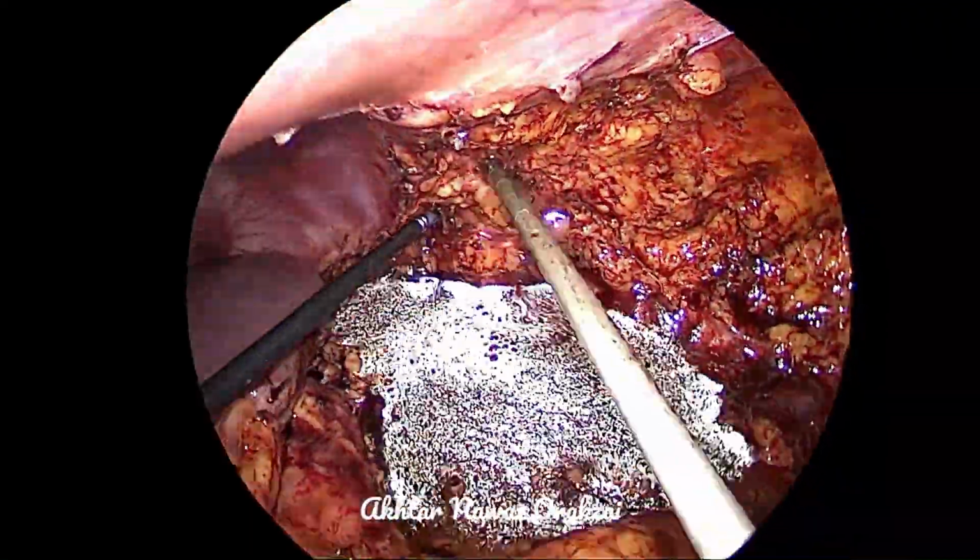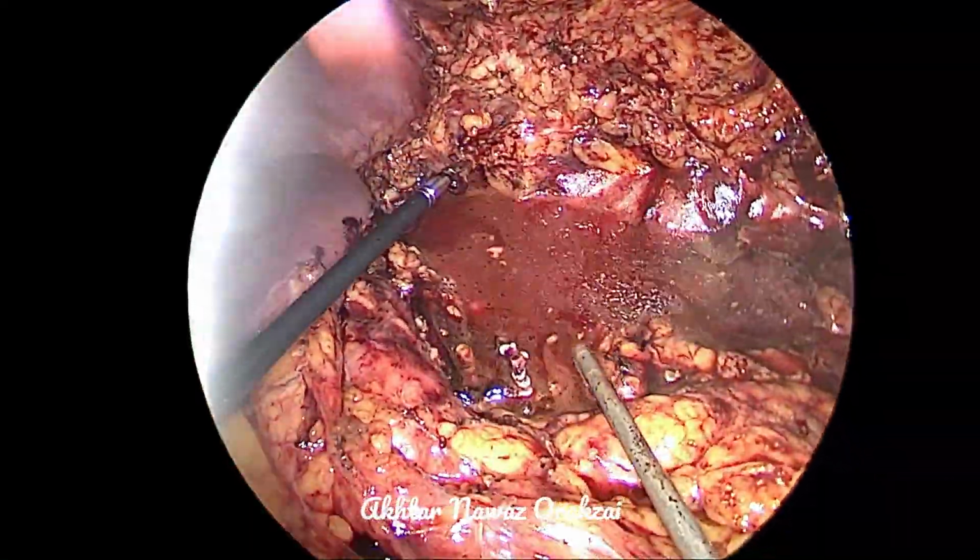So the kidney is then mobilized and we will clean the area and then place a drain.